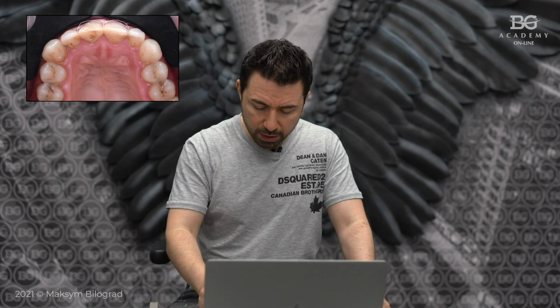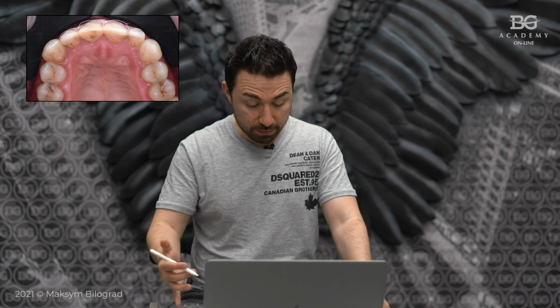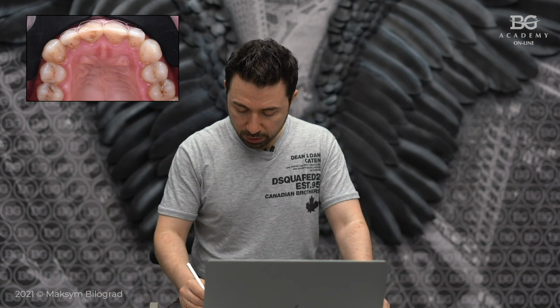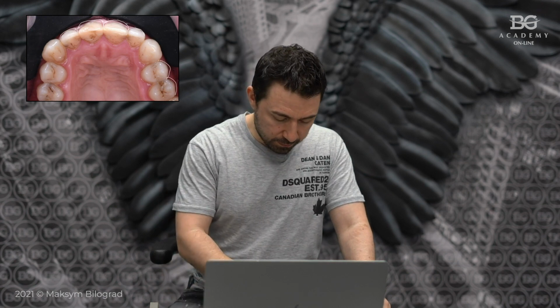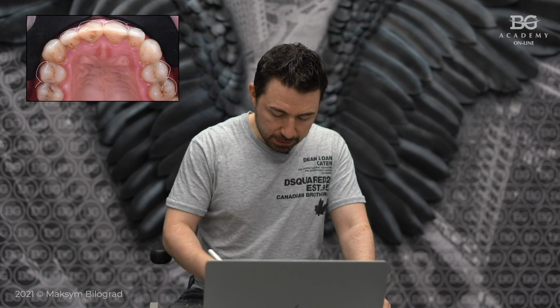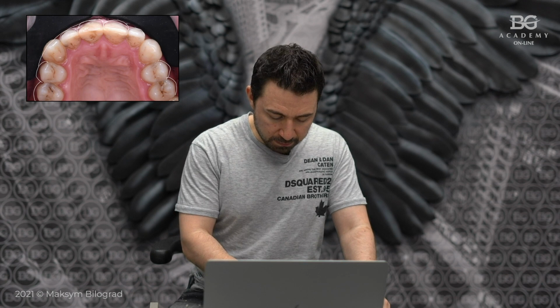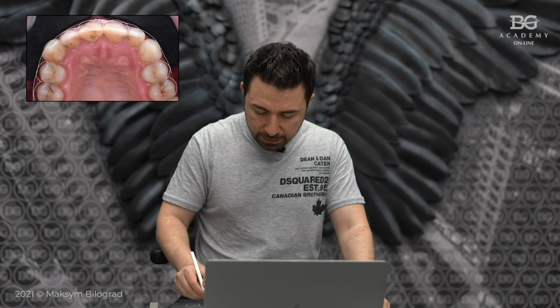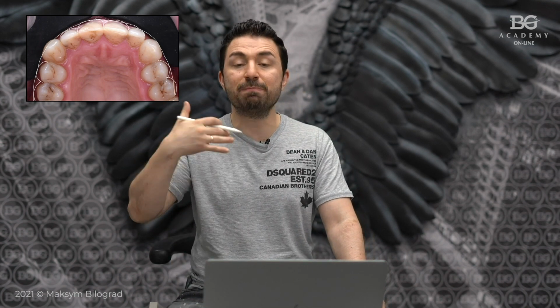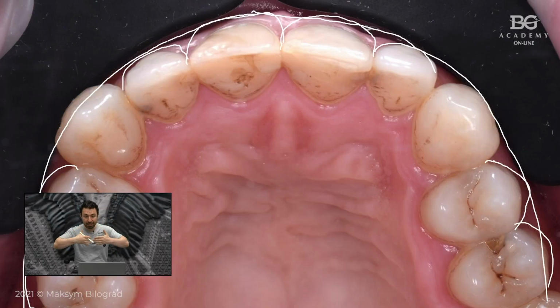Let us move on. We do some additive things. Premolars, definitely we can add, because they are retruded, so we can add some ceramic over the surface. And now let us draw an aesthetic curve, and we see that we need to prep canines that much, as I expected from the very beginning. Just adding premolars, centrals, a little bit of the laterals, we can win the game.